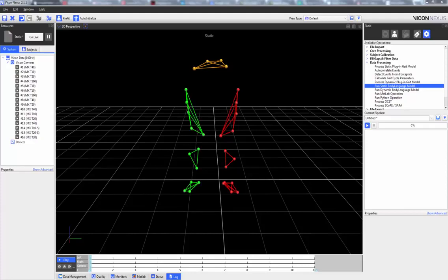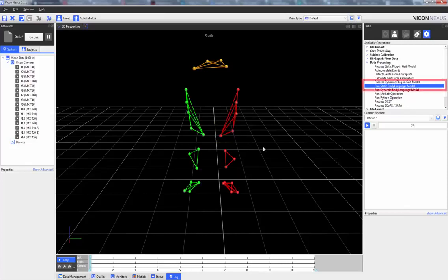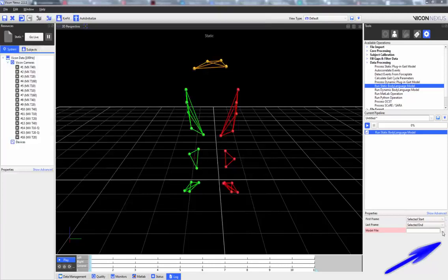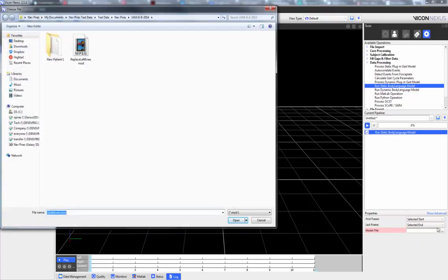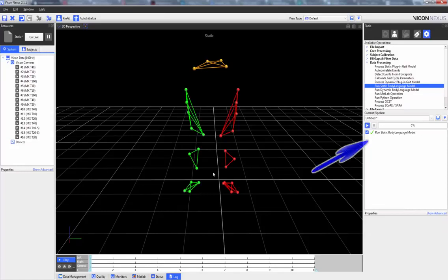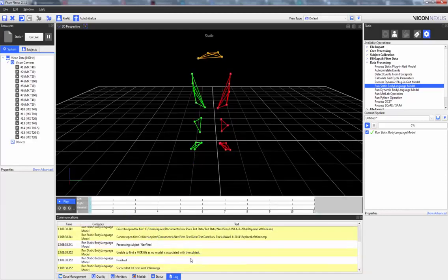Now let's see the code in action. I've already loaded a static trial with all the appropriate markers: the three on the left thigh cluster and the two left knee markers. I'm going to load the run static body language model pipeline operation, load the model file, and double click it. When I press play, we can see with the check mark that the model has been run successfully. Opening the log, we can see that the code has succeeded with zero errors.